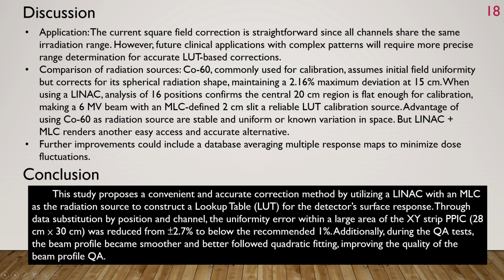Conclusion. This study proposed a method for constructing a lookup table based on the LINAC as the radiation source for the surface response of the detector. Through data substitution by position and channel, the uniformity error within a large area of the XY strip detector was reduced from plus or minus 2.7% to below the recommended 1%. Additionally, during the QA test, the beam profile became smoother and better followed quadratic fitting, improving the quality of the beam profile QA.